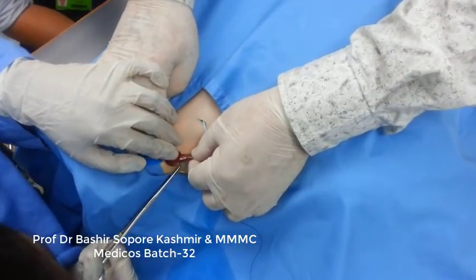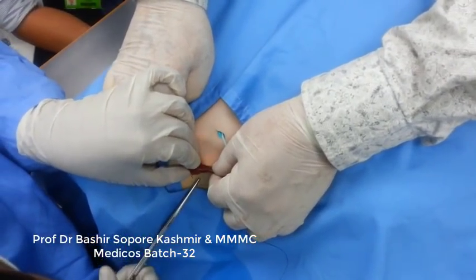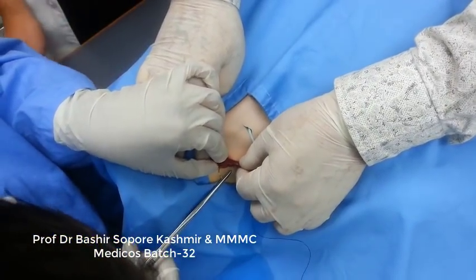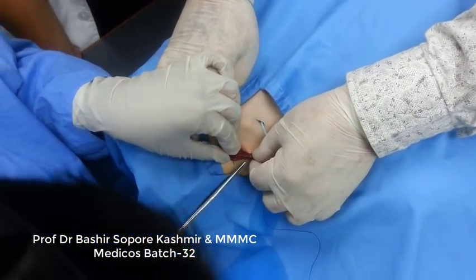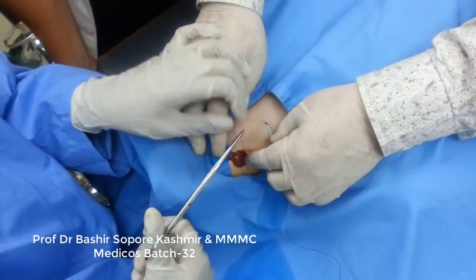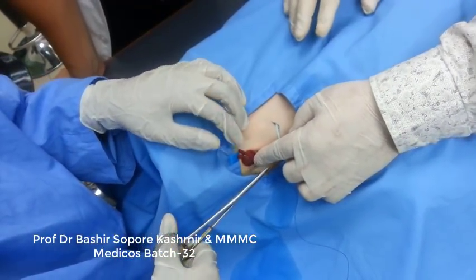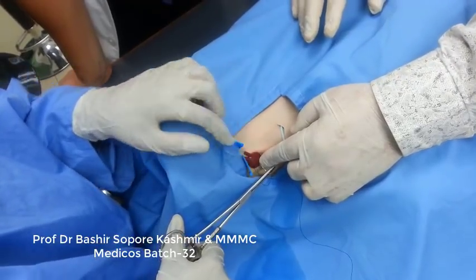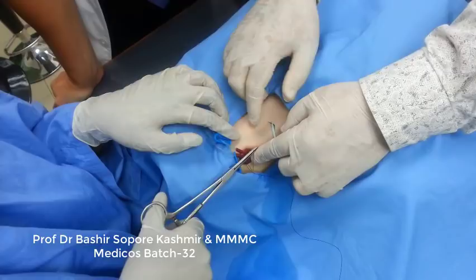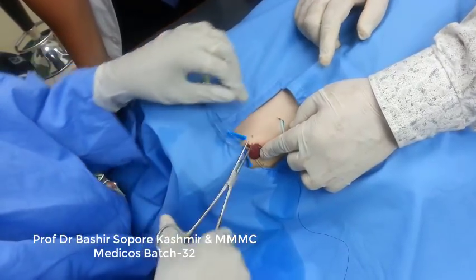So we are suturing it. You understand my point? We are anchoring the catheter with the skin. Okay, done? For example, we have done it. We are just showing it that we are doing suturing. So leave it now.